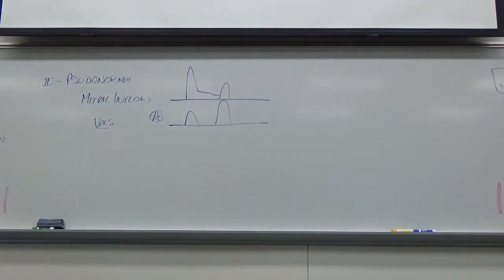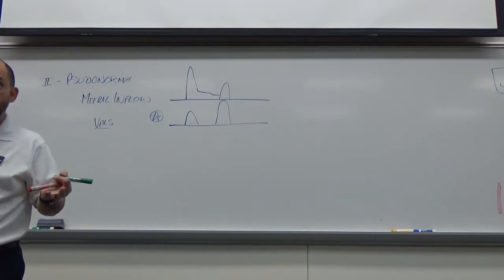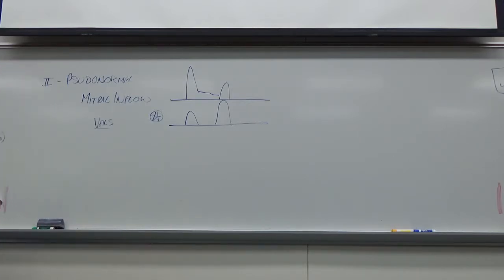Now again, do I need to do Valsalva to diagnose this? No. Back in the day before we started doing tissue Doppler, we did have to because we didn't have another mechanism. So now you can live without doing Valsalva and just get your information from other sources. However, Valsalva is not very hard to do. I'm already on that valve. I just have the patient hold their breath, bear down, and see what results I get.